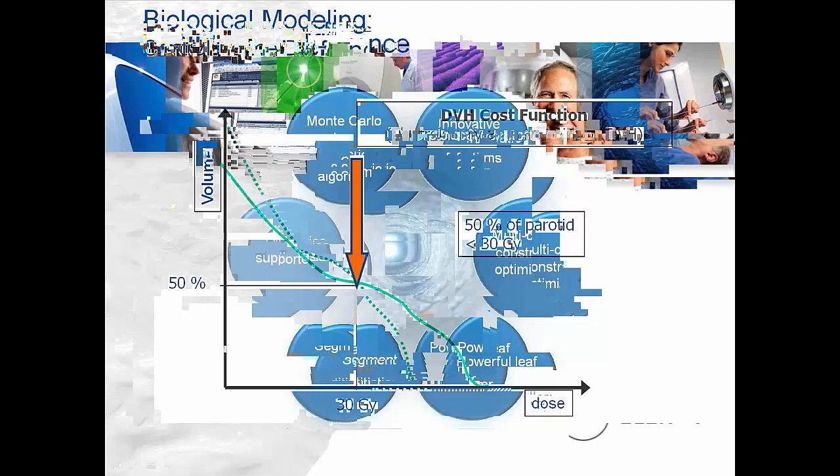Constrained optimization: a lot of systems today use unconstrained optimization, where you put in your targets and organs at risk, set your weighting, and they're kind of fighting amongst themselves. In Monaco, it's constrained optimization—the PTVs come first before we start worrying about the organs at risk. There's a checkbox on the constraint page that lets you use a manual weighting feature. You could calc out a plan unconstrained from the start, or use constrained and let Monaco do it, then go back and push back on structures you need to tweak.